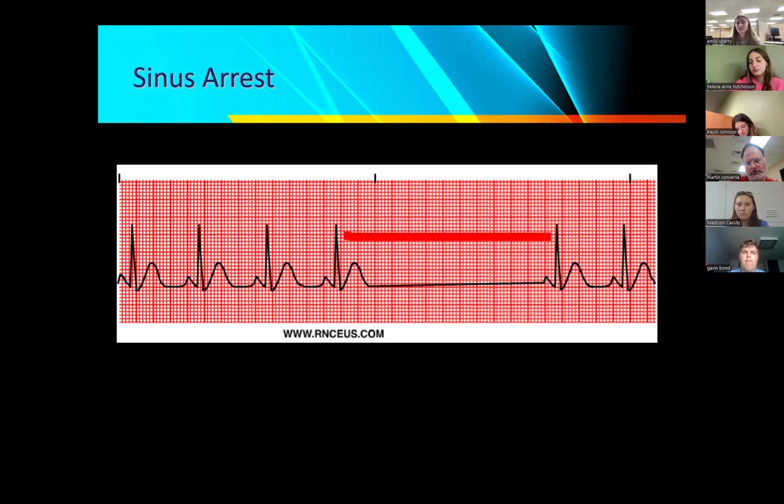All right. Now, remember, we talked about Marty had one a while ago that was sinus bradycardia. And so we look at our patient. But again, in this particular situation, especially if we have a bunch of these arrest phases in here, or if it, for whatever reason, now begins to get longer, our heart rate is going to drop.